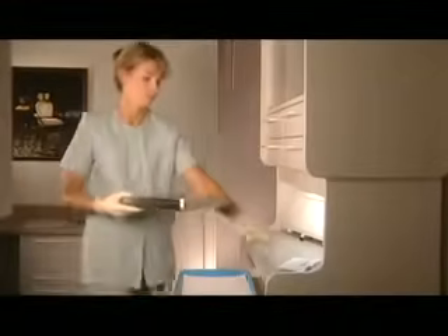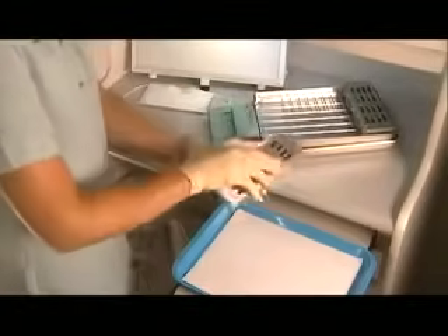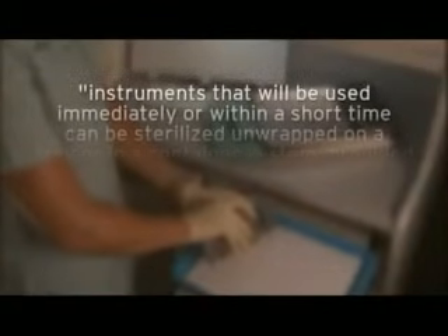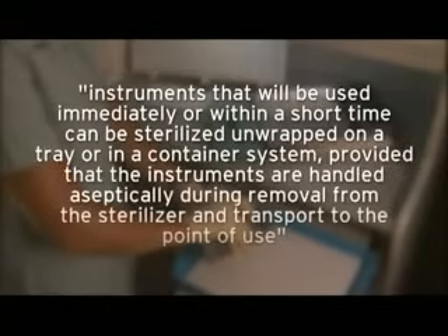All Statum sterilizers use closed-door drying, unlike some conventional autoclaves which dry using an open-door technique. The Statum's superior closed-door drying avoids the possibility of recontamination. Another benefit of Statum is its unique fully removable chambers, which allow you to use the unwrap cycle while fully satisfying the CDC guidelines for semi-critical instruments. These guidelines state instruments that will be used immediately or within a short time can be sterilized unwrapped on a tray or in a container system, provided that the instruments are handled aseptically during removal from the sterilizer and transport to the point of use.